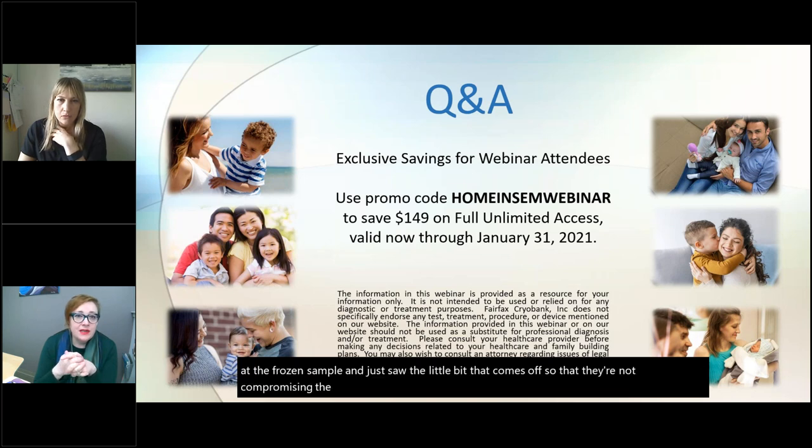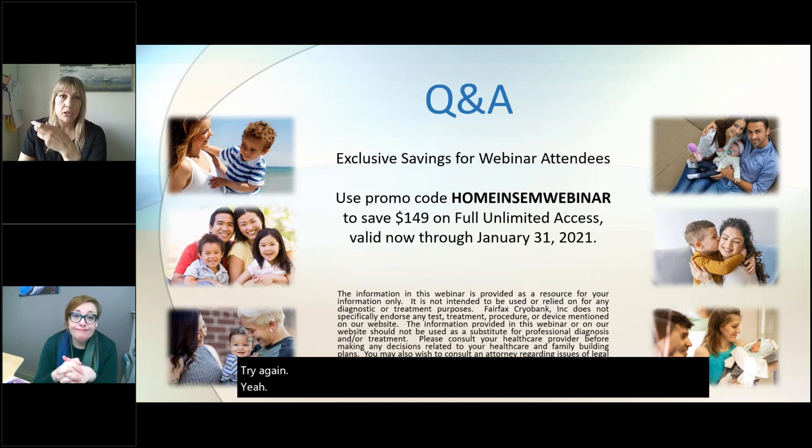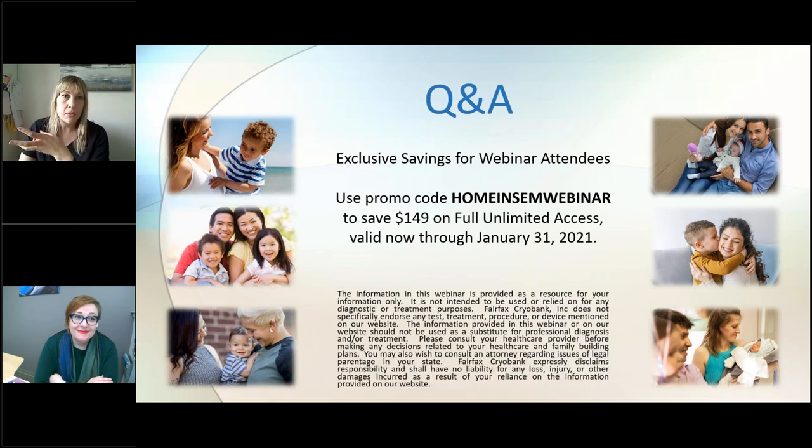But Kate, is there ever an instance where you would thaw, refreeze and thaw again? No, we use the entire vial. The vials are frozen to exactly the right amount, so we've never had to waste any of the vial, and we never would. If we get a count that's over 10 million, and it ends up being, I don't know, 11 million, 14 million, even 15, we'll inseminate with that. That's right. Yeah.